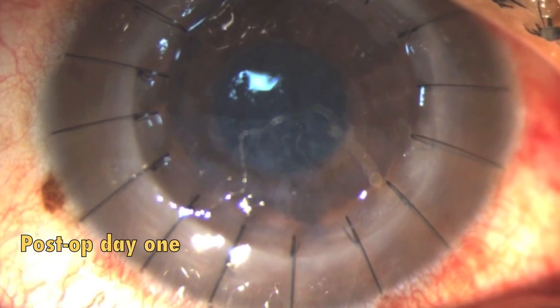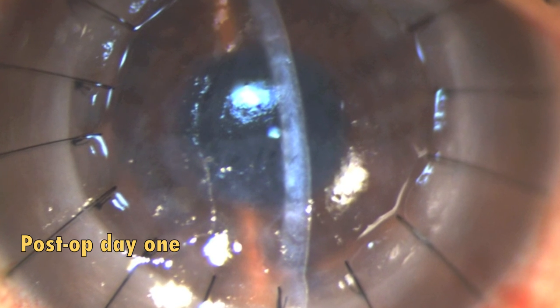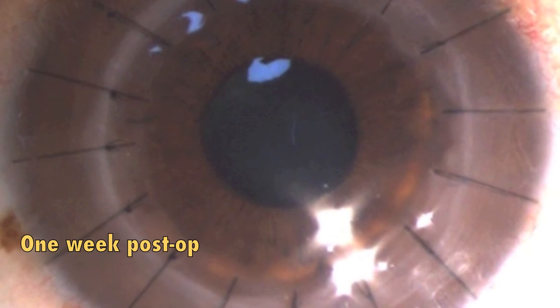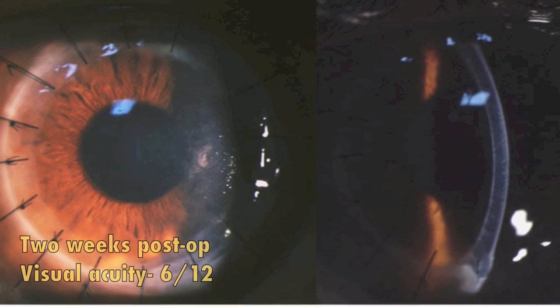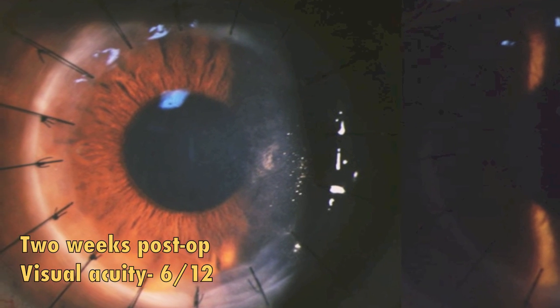This is postoperative day 1 clinical picture which shows graft edema along with Descemet folds. A 1-week post-op showing improved graft clarity. A further follow-up at 2 weeks shows a clear graft with a good visual acuity.